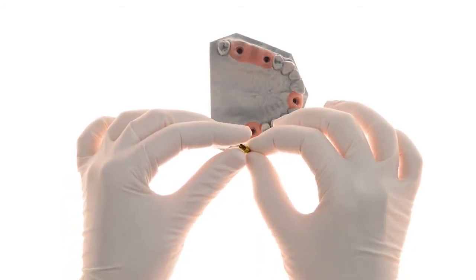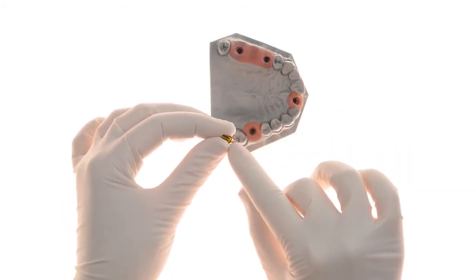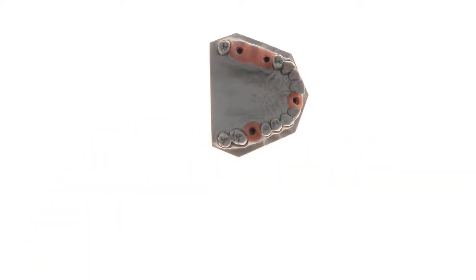This is the unique MIS EasyBase abutment. As you can see, it has a side cut which allows access of the angled screw and screwdriver.